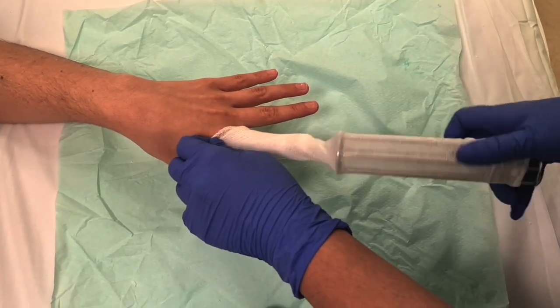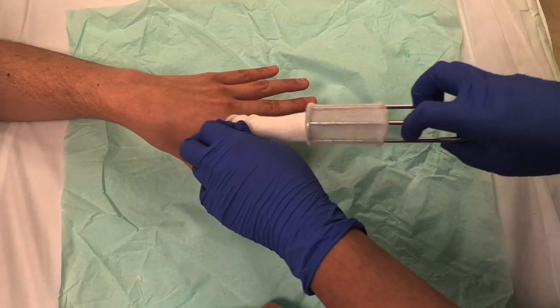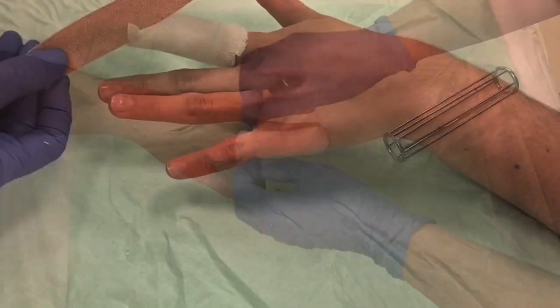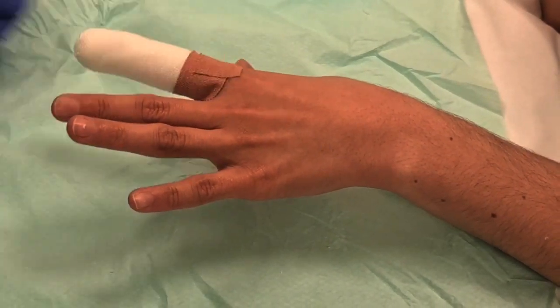The other way is just to dress the finger itself. Make sure that you get it approximately the right length so that it's nice and tidy around the base of the finger. Then secure it with some Elastoplast and just put a little nick in it so that it fits into the web space tidily without ruckling up.